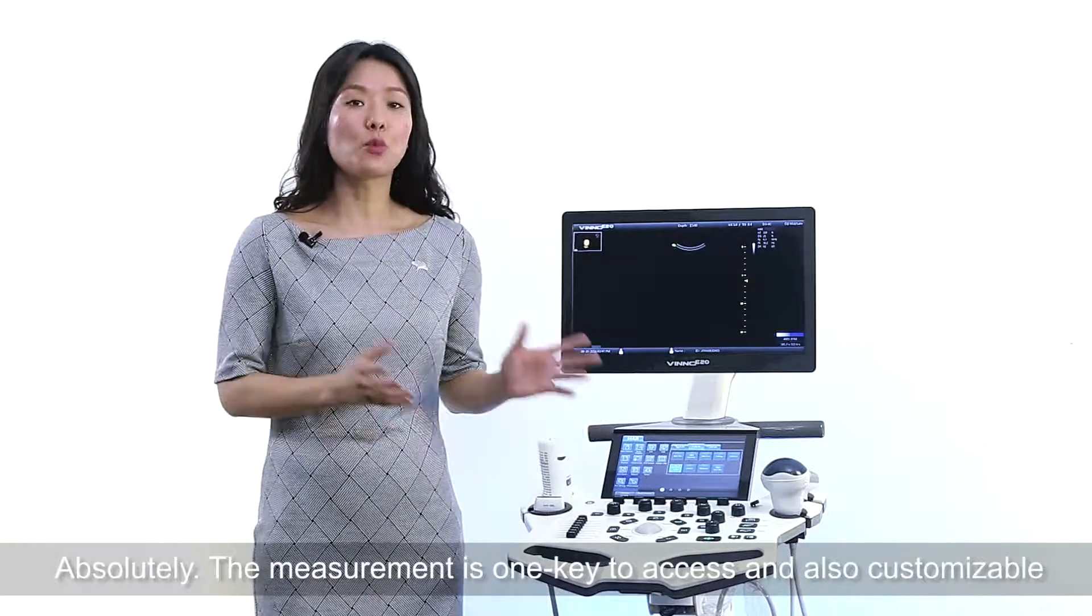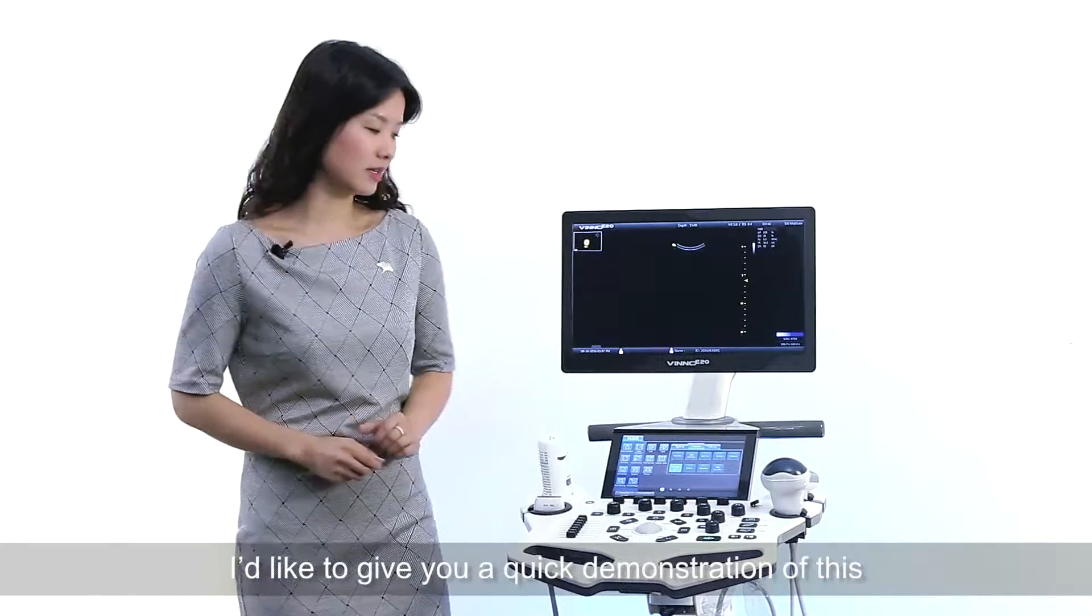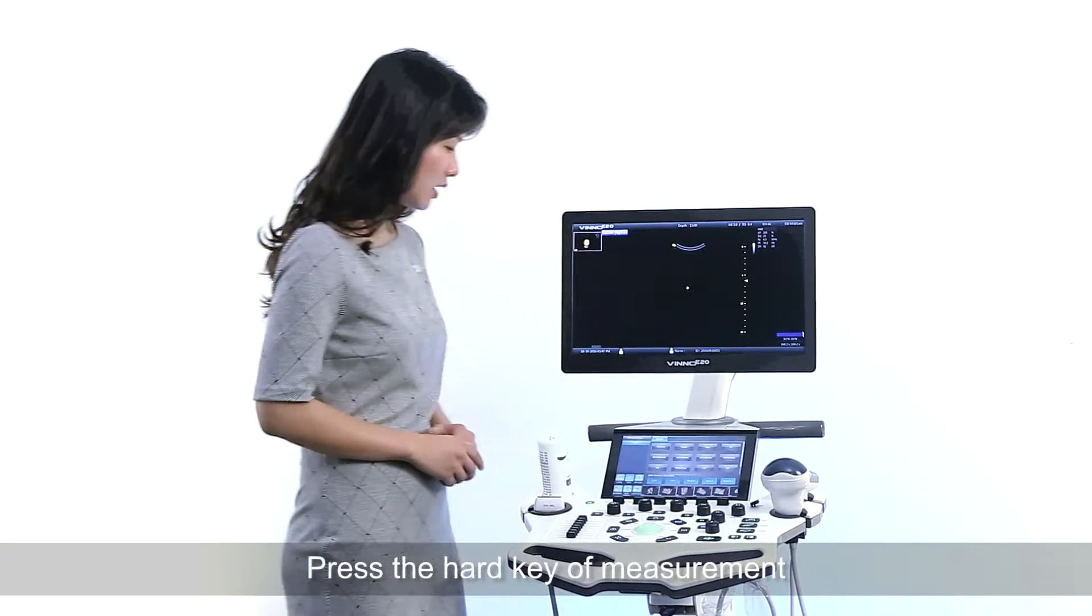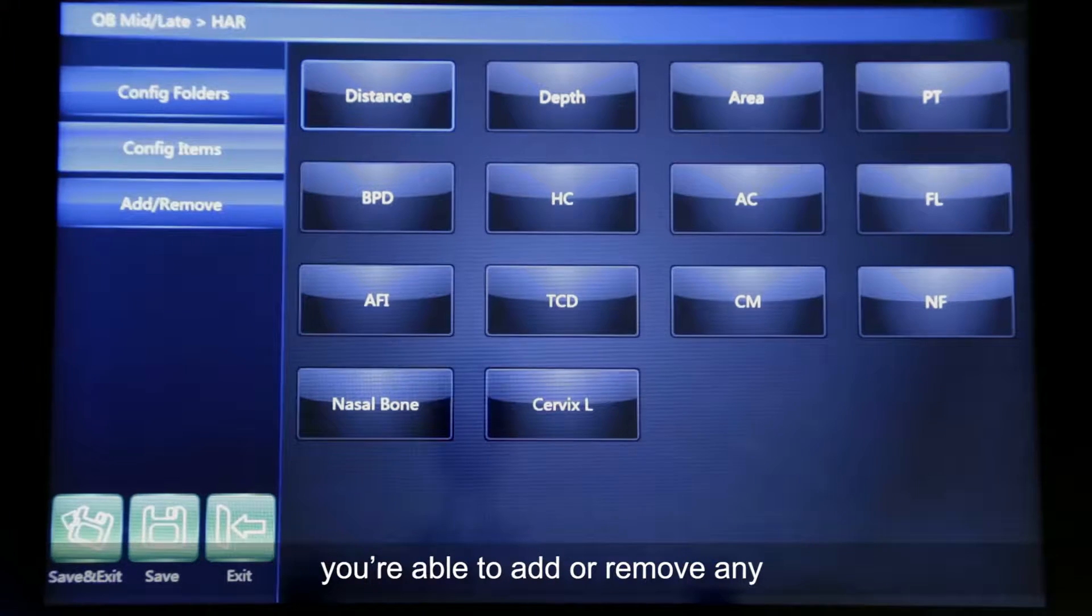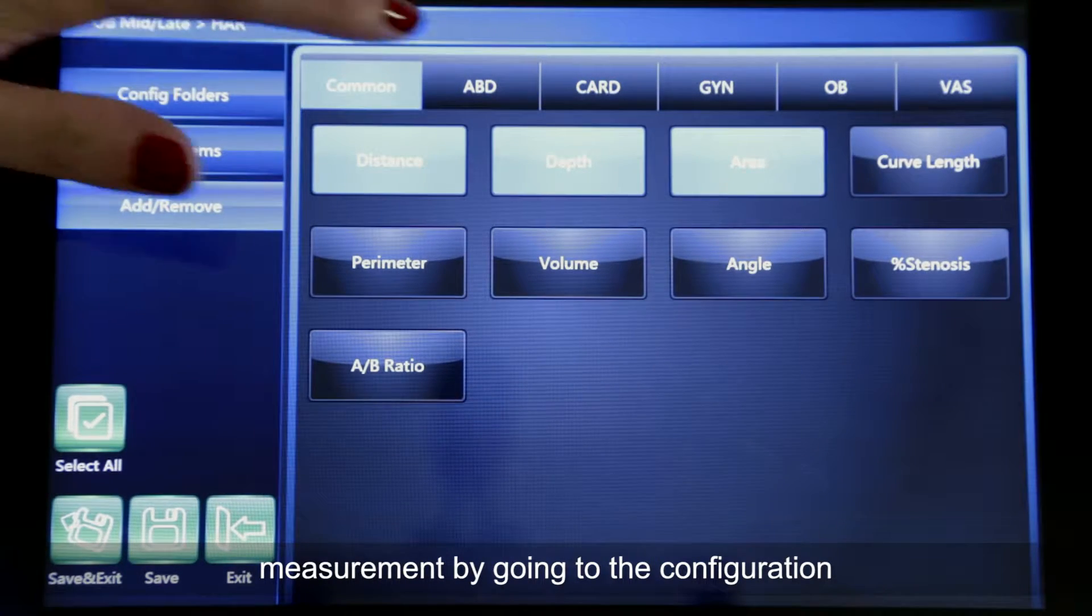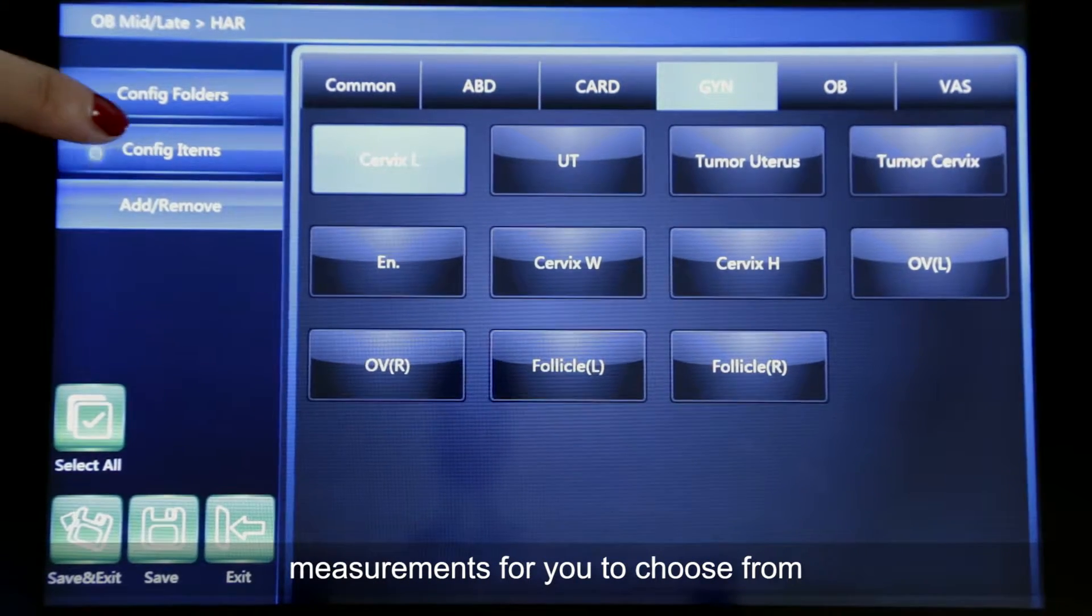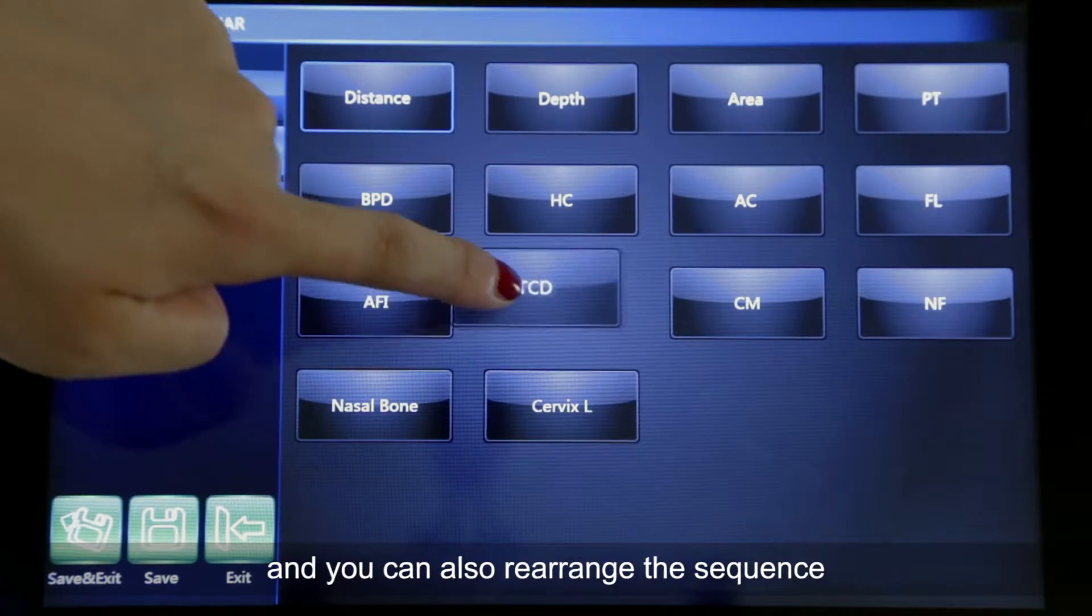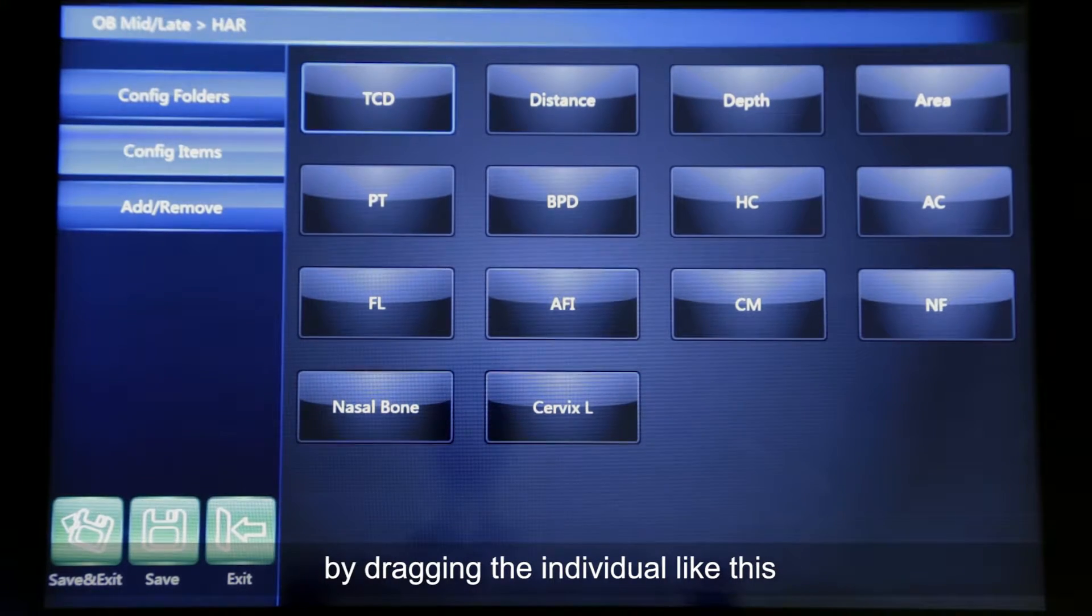The measurement is one key to access and also customizable. I'd like to give you a quick demonstration of this. Press the hard key of the measurement. You're able to add or remove the measurements by going to the configuration. We have a huge library of measurements for you to choose from. And you can also rearrange the sequence by dragging the individual like this.